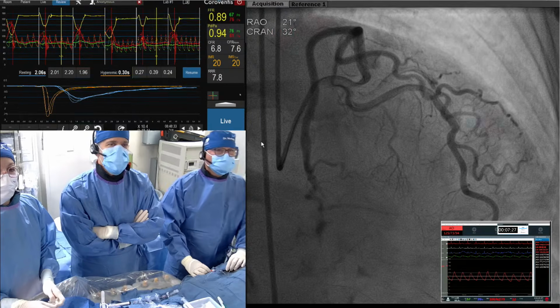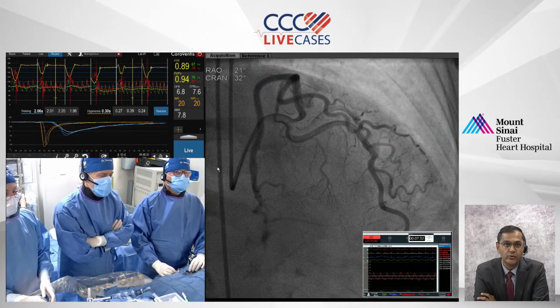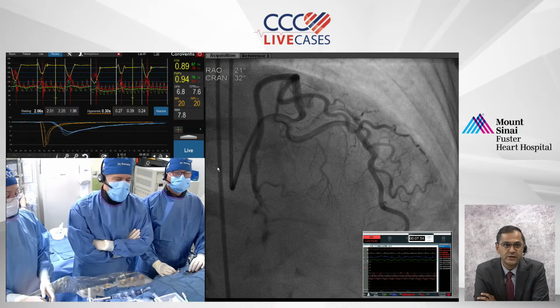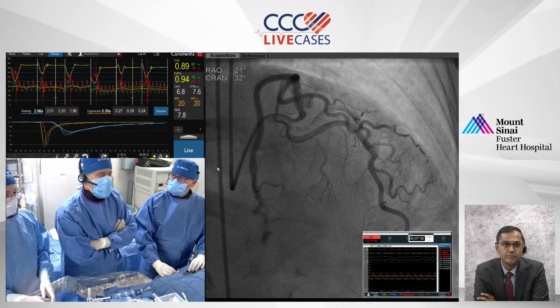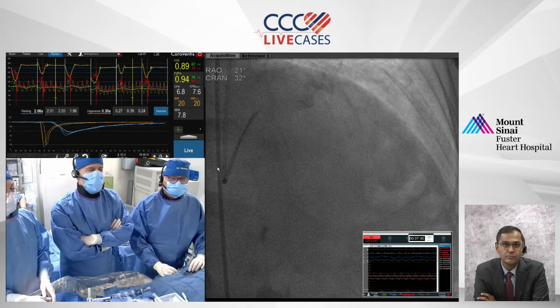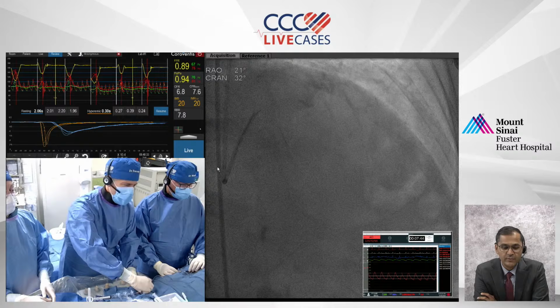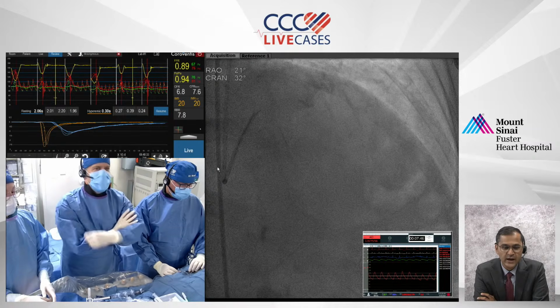I think so. Yeah, it looks that way. Your acetylcholine testing was normal, and then your wire-based testing here is also normal. So good reassurance for the patient. Yeah. I think with that, Samita, are there any questions that have come in or anything that you want to ask us? There's a lot of people online, and so if people have questions, please put them in the chat.